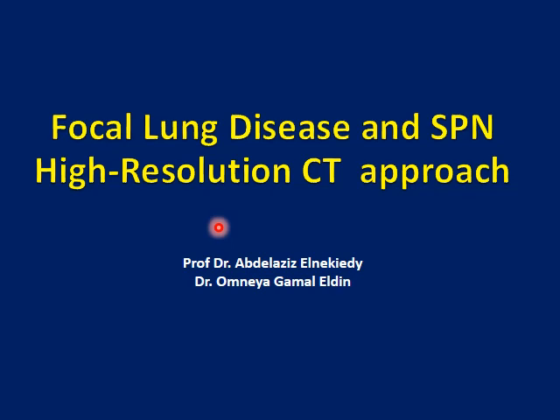We will speak today in this lecture about the approach using high resolution CT for focal lung disease, solitary pulmonary nodule or nodules, as well as masses.